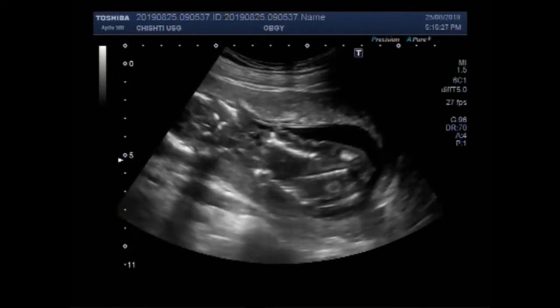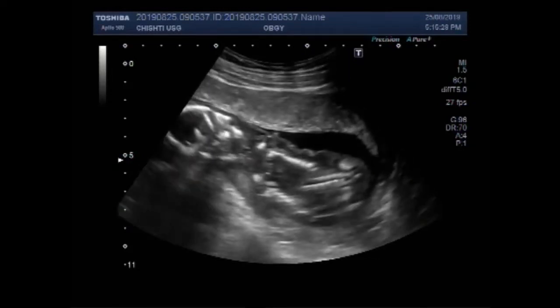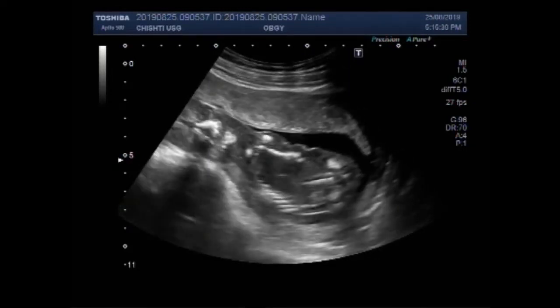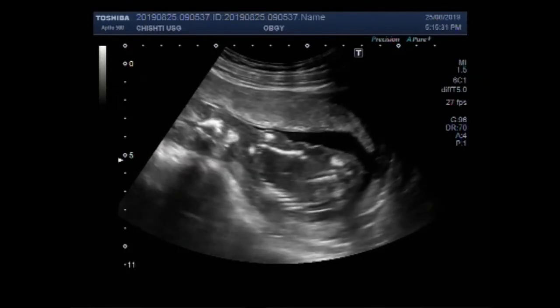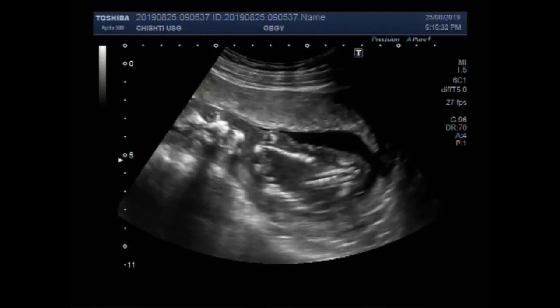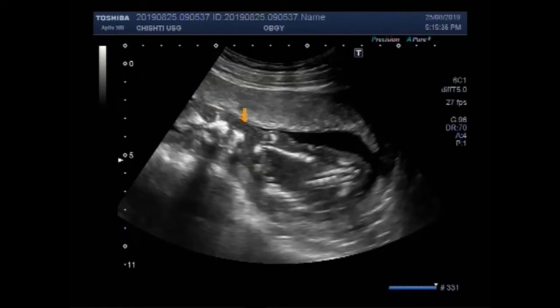The placenta is anteriorly attached. Now, this is the fetal soft tissue edema — soft tissue edema.